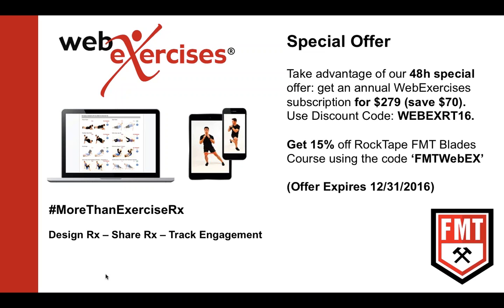So what we're seeing through the research is that feather strokes that are quick, upwards of 30 seconds to tolerance, that means 30 seconds to roughly 2.5 minutes in one vector, is a good way to mitigate pain. So the way we teach it within the class is we do these 4 vectors. Let's say we're over an anterolateral ankle sprain, right around the lateral malleolus, which is a pretty bony area to treat.